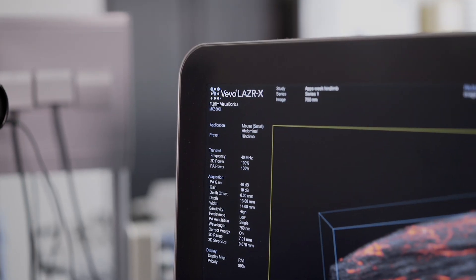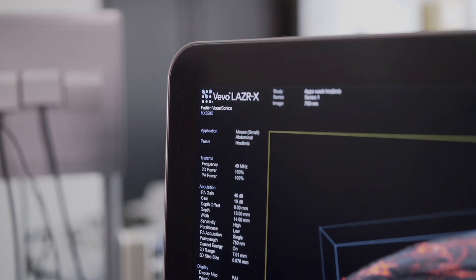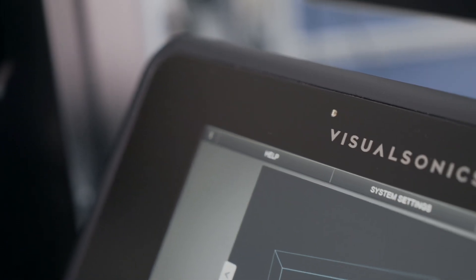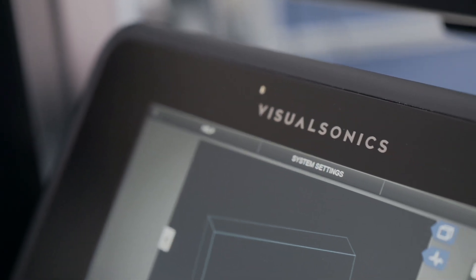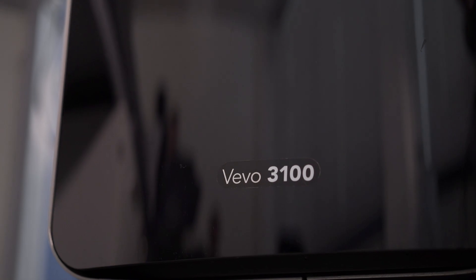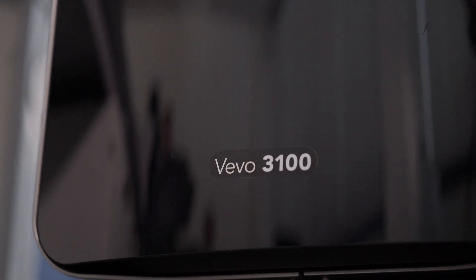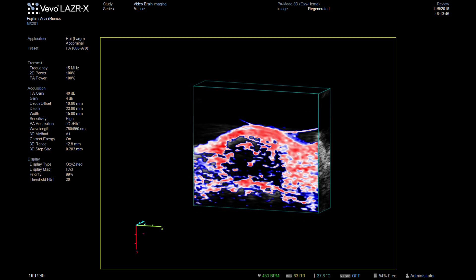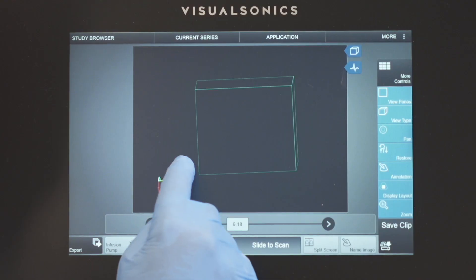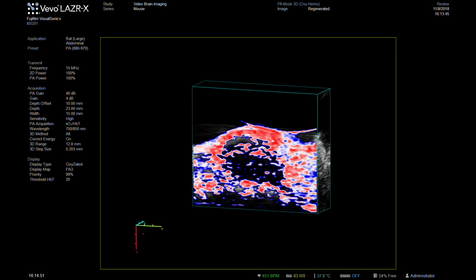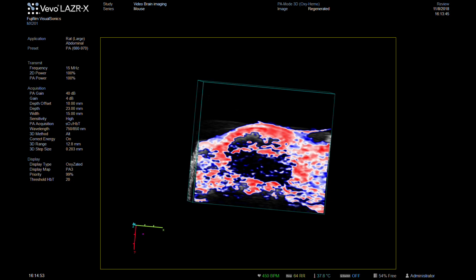The Vevo LAZR-X system is a unique multi-modality imaging system combining ultra-high frequency ultrasound and photoacoustics to gather anatomical, functional, and molecular information from just one image acquisition. This short demo shows just how user-friendly this compact and flexible platform is for brain imaging.